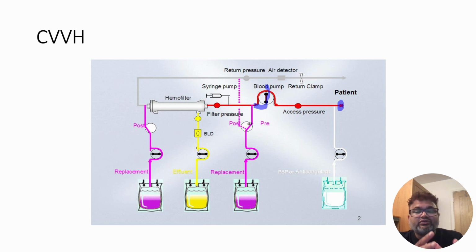So we try to give as much as post filter, because post filter makes it more effective, but again with the risk of clotting.